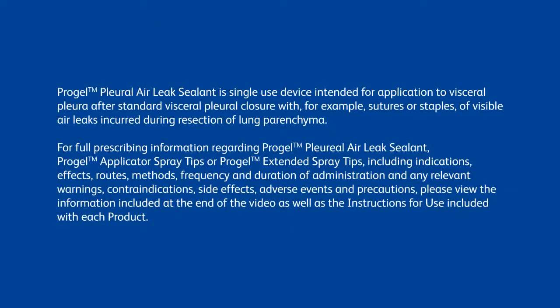Progel Pleural Air Leak Sealant is a single-use device intended for application to visceral pleura after standard visceral pleura closure with, for example, sutures or staples, of visible air leaks incurred during resection of lung parenchyma.